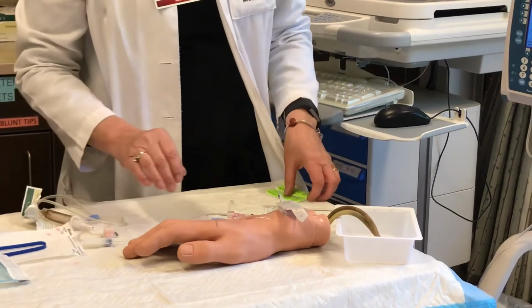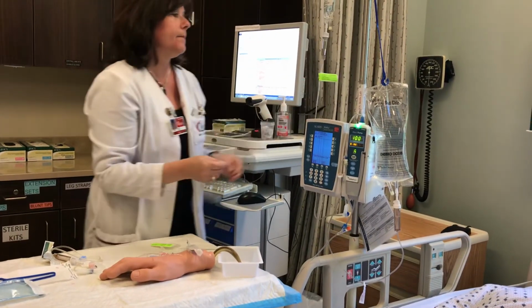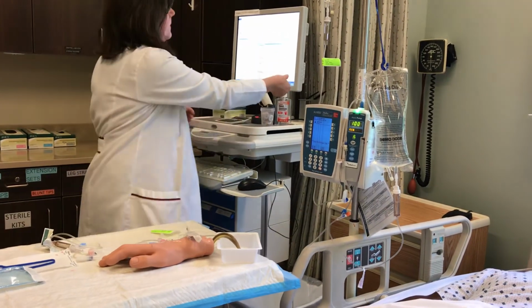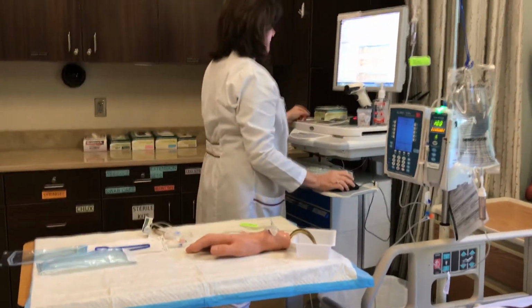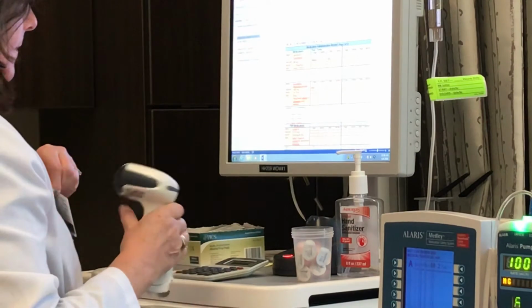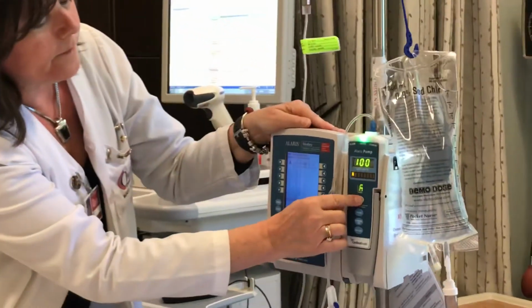Label IV piggyback tubing. I would write my initials, date, and time, and apply it to the secondary tubing. Reposition patient for comfort, call light within reach, leave patient in safe environment, and perform hand hygiene. Document IV piggyback administration on MAR, 6th right, and scan badge. For this checkoff, as the student is documenting the IV piggyback on the MAR, the instructor will reset the IV pump as if the IV piggyback has infused completely.